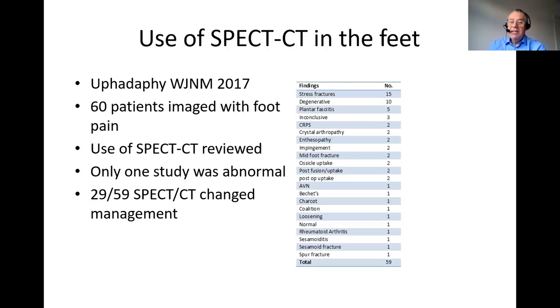Just to finish off MSK, we can do knees as well, and there's a lot of data on that, but I'm just going to finish off with the feet with some work that we did, which was published in the World Journal in 2017, and that's free to download. We looked at a series of 60 patients imaged with SPECT-CT of the feet, and only in one study did we really fail to find a diagnosis, but we managed to change management in about half of our patients.